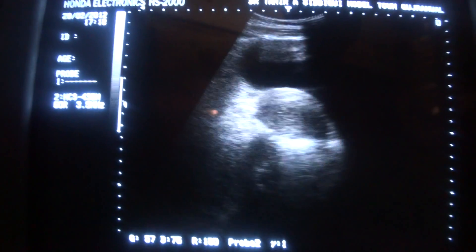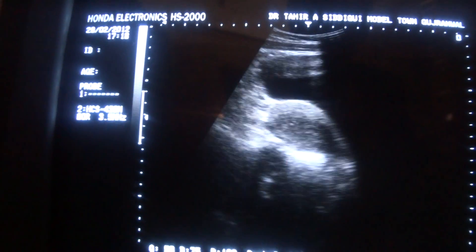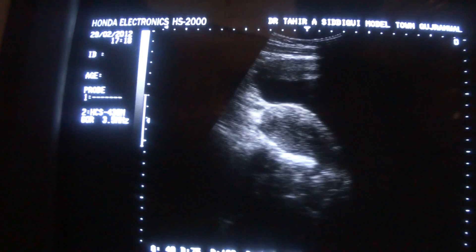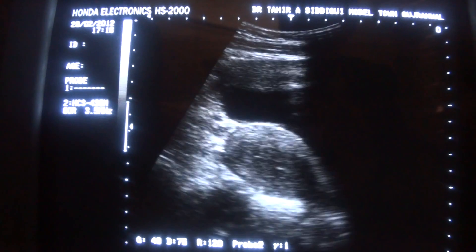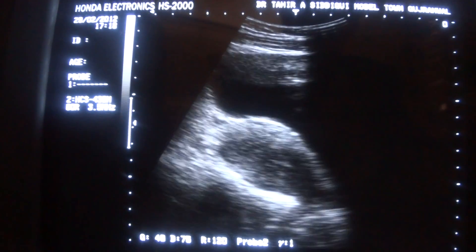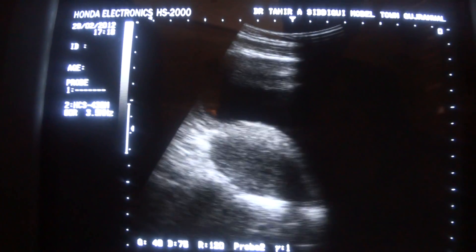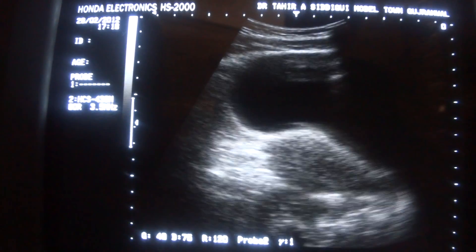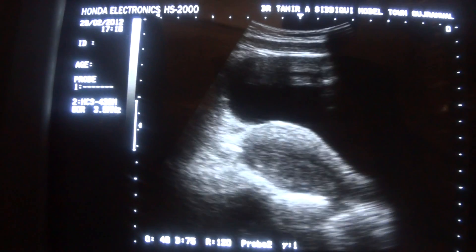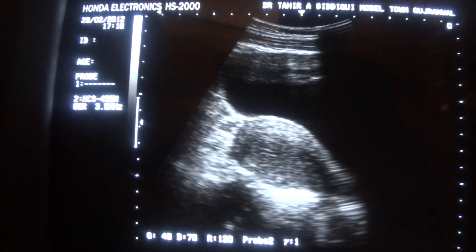This is the ultrasound study of the nulliparous female, young, 16 years old. This is the longitudinal section.